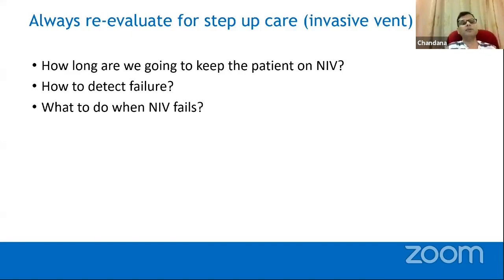So underlying management. You just try to manage the patient's life with these devices. They are not at all treatment modalities. They are treatment in the sense that they won't treat the underlying pathology. It will improve the oxygen, but it won't cure the underlying pathology. So you have to do something for the underlying pathology, maybe immune therapy, maybe antivirals, so many different kinds of things.